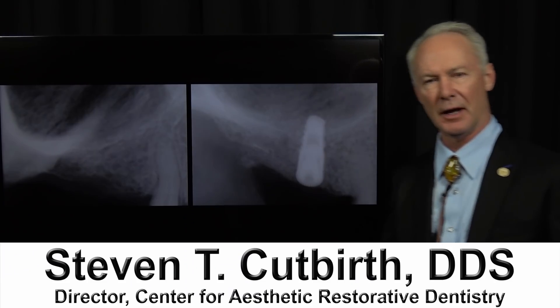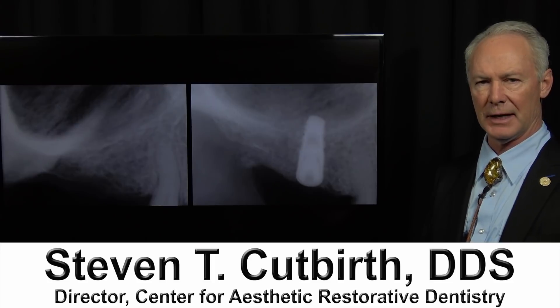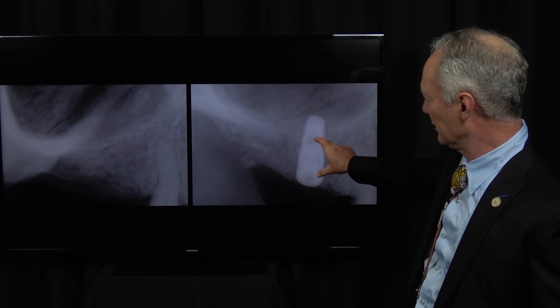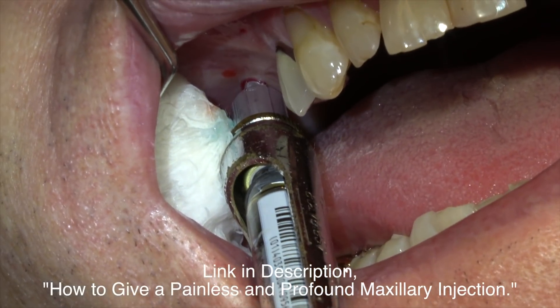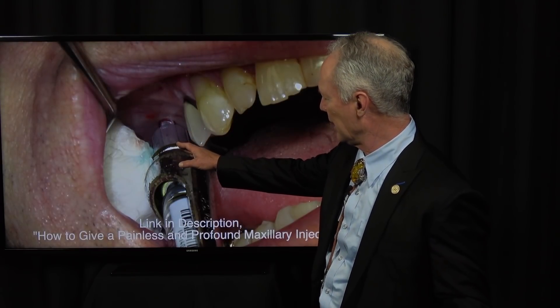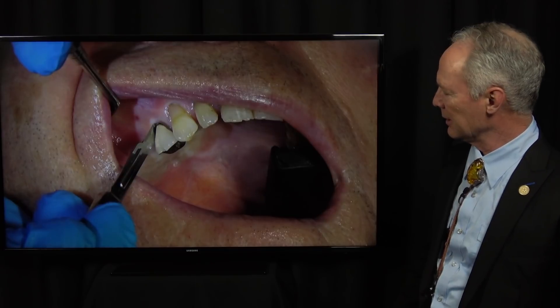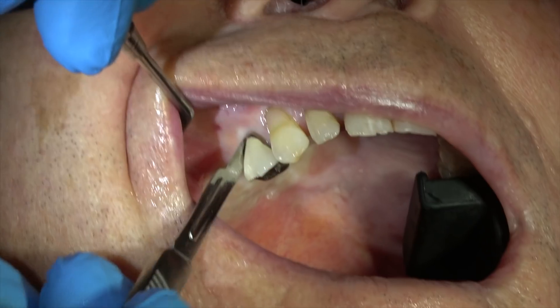Let's discuss placement of a root form implant in a maxillary bicuspid space with limited vertical bone, and then bone grafting of a dehiscence following placement of the implant. This gentleman had been without this second bicuspid tooth for many years. We can't place an implant in the first molar position without a sinus lift and bone graft, but the second bicuspid graft is going to greatly enhance his chewing ability and aesthetics.